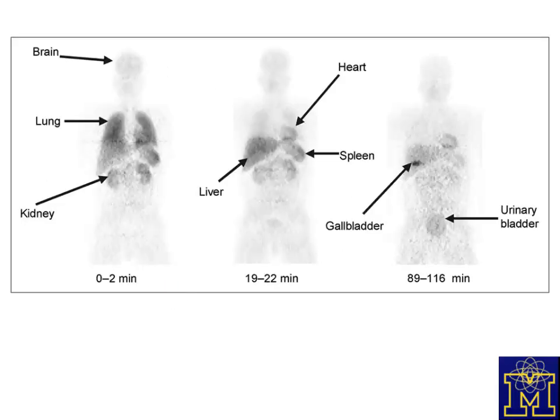And indeed, when injected into man, it has a biodistribution that's very favorable. So with initial injection, it spreads predominantly to peripheral organs, but you can see brain activity and uptake, which is very faint but present. But as time progresses, you can see that it shows retention in the spleen, and we think that's because of the known binding to spleen and here in the kidneys because of the TSPO protein in those areas.